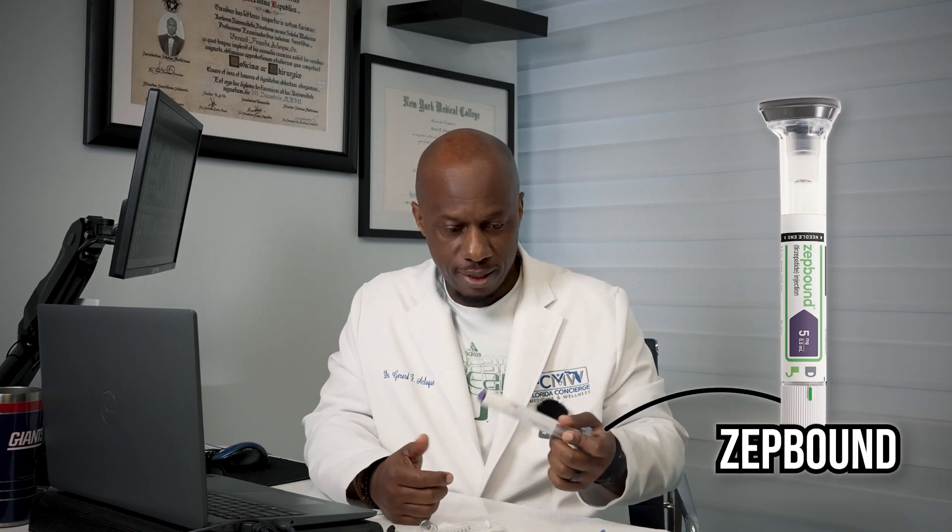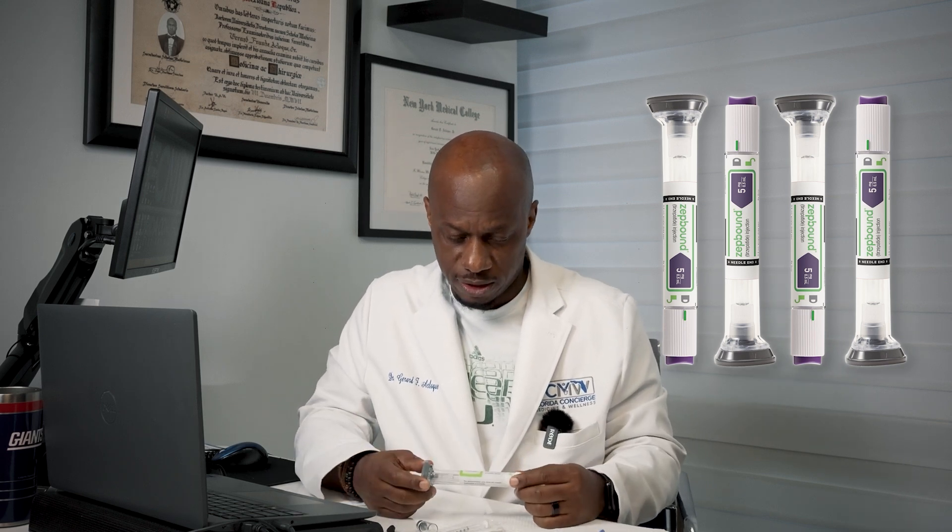This is a Zepbound sample pen we keep in the office to show patients what they look like, feel like, and what the process is for using them. These pens come in a box of four — whether it's Zepbound, Wegovy, or any other auto-injector pen, they usually come in boxes of four.